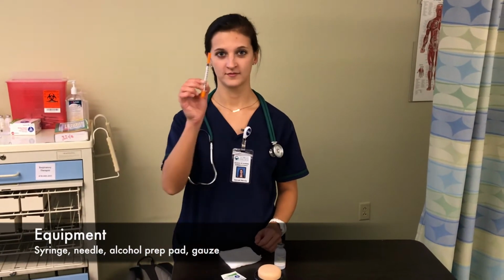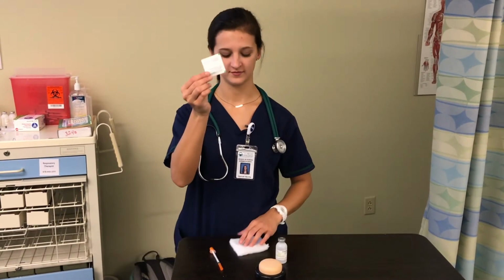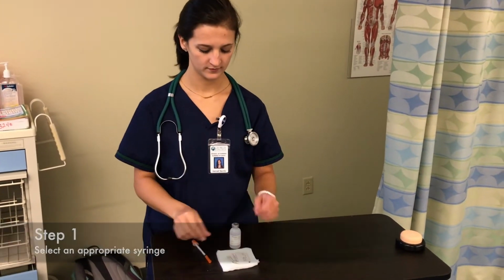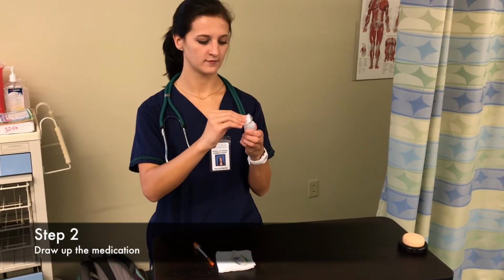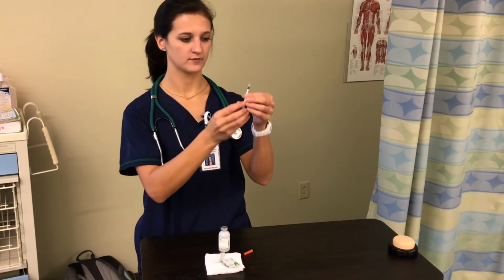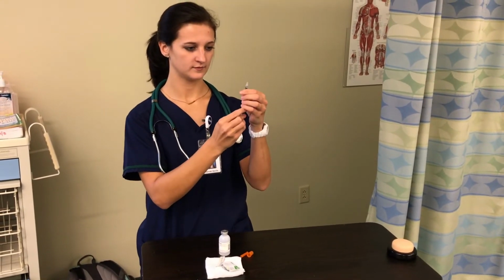To administer a subcutaneous insulin injection, you will need a syringe and needle appropriate for volume and site, an alcohol prep pad, and a gauze pad. First, we're going to select an appropriate syringe and needle and draw up the medication. Today we are drawing up 4 units.